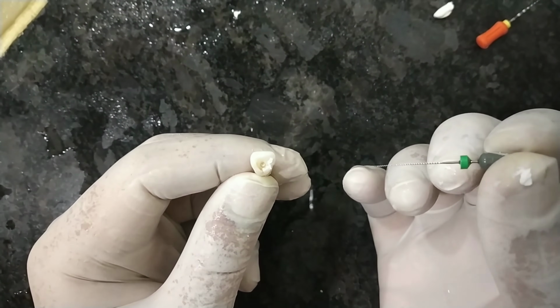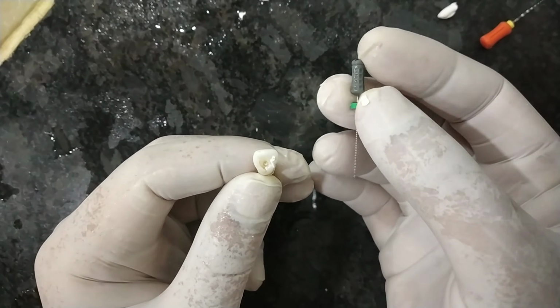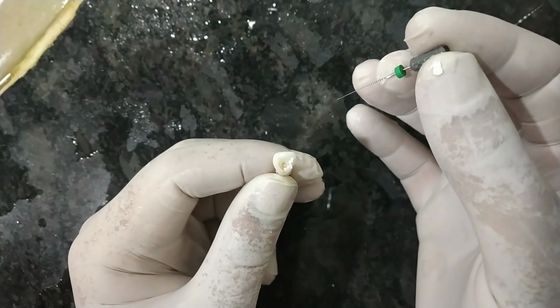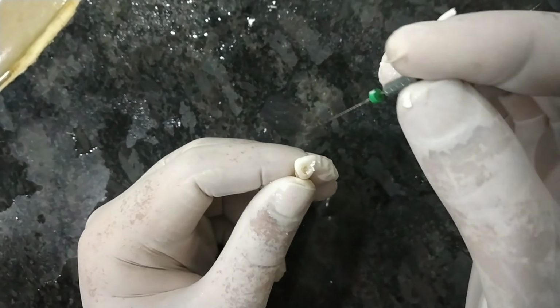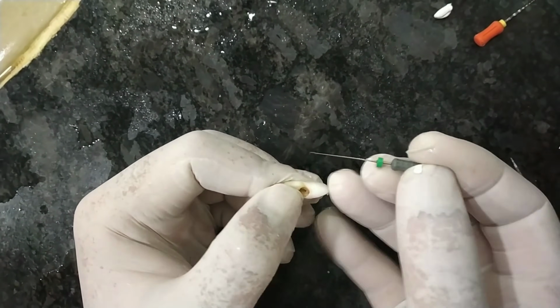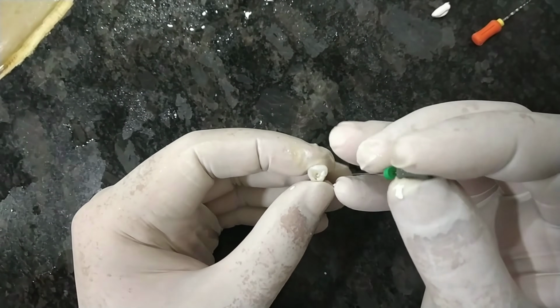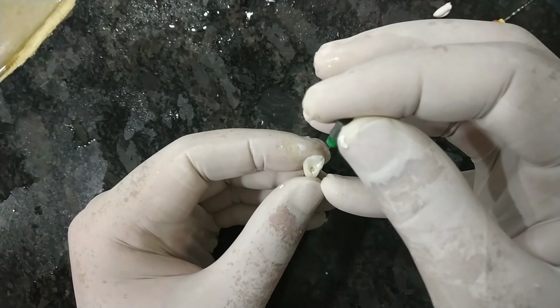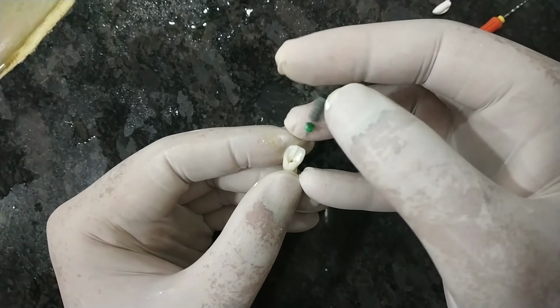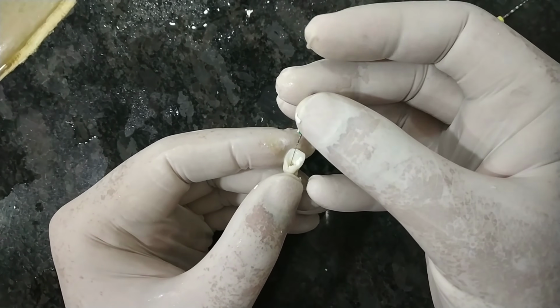So this access opening has been done, and as you all know, this is K file number 8, just to check the patency of the canal. I told you in the video there should be straight line access, so this file should go straight into the canal. What I am doing is seeing whether the access opening is done or not. We take the file like this and insert it into the canal a little bit with the watch winding motion.